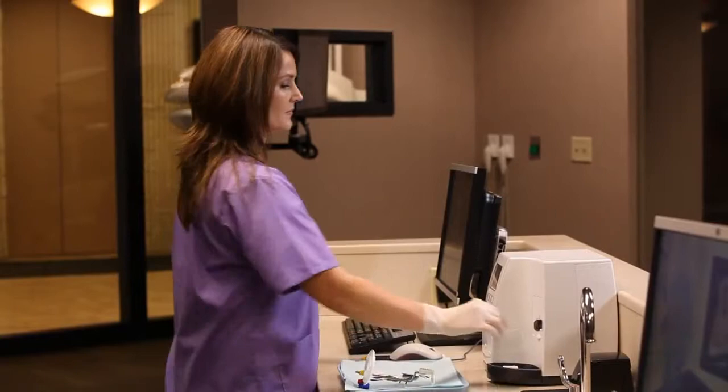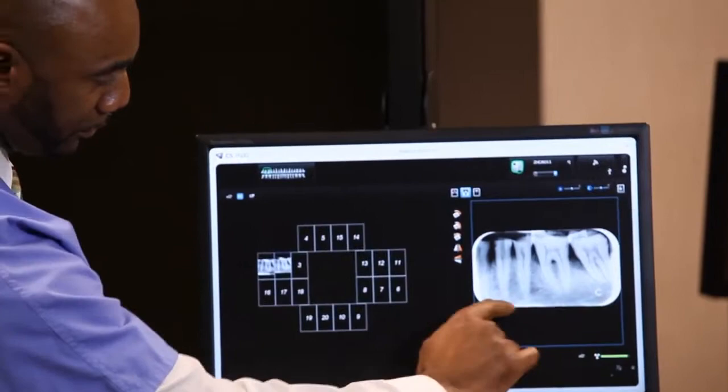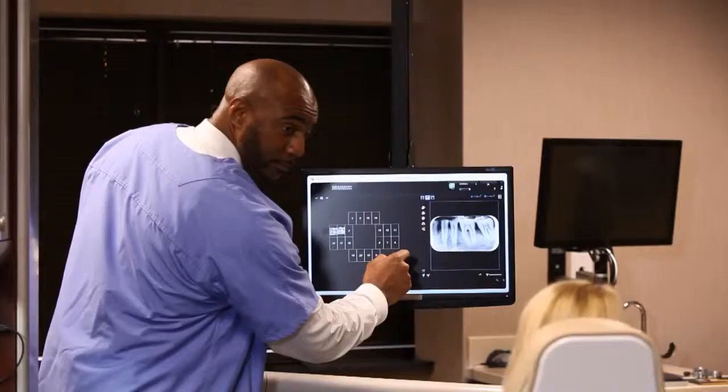The images are sent directly from the CS7600 and mounted automatically in the correct position on the computer screen in the appropriate patient operatory. The system facilitates simple review and sharing, improving communication with patients and leading to greater case acceptance.